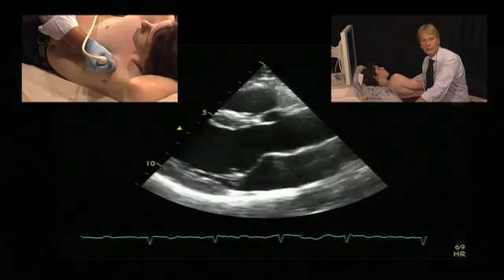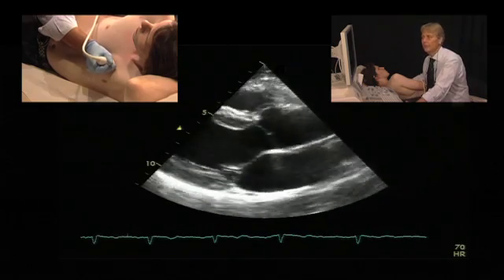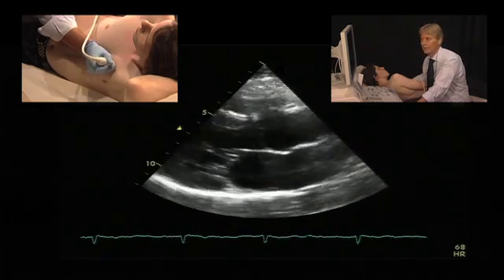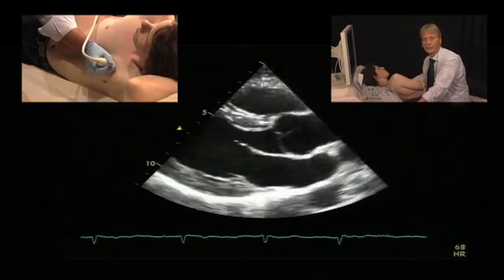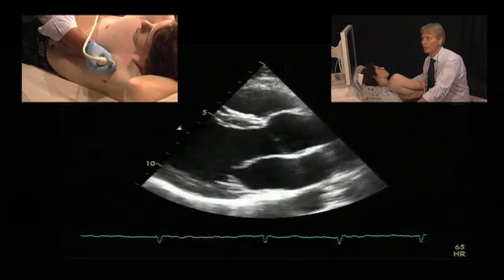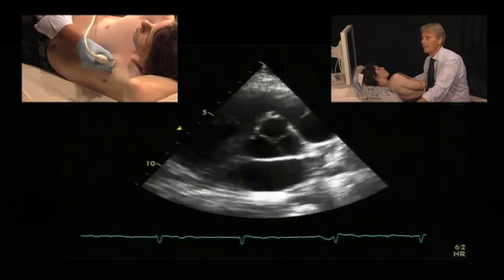To perform an M-mode measurement of the left ventricle, you need a parasternal long or short axis view. You can actually do it from both. I will show you how to do it from the short axis.